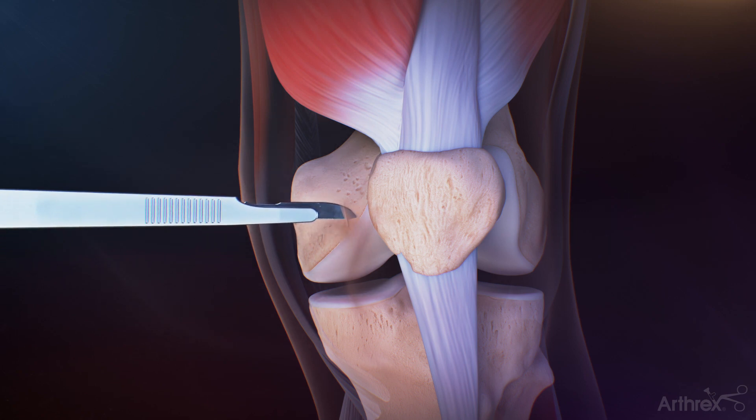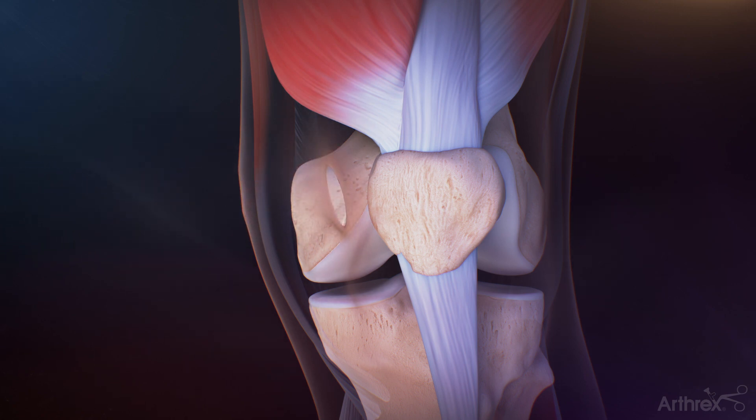Palpate the medial patellar border and make a 2 cm skin incision from the superomedial corner extending to the center of the medial edge of the patella.